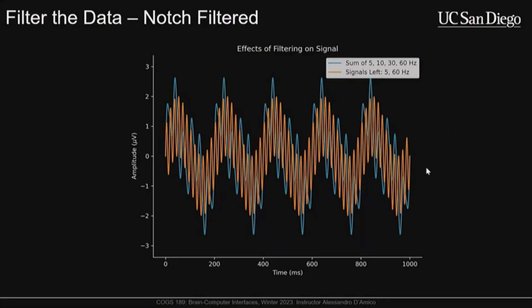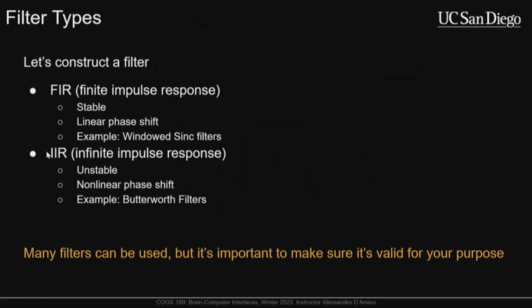But of course, because we have slower oscillations, we're also limited to a lower order set of filters. And anyway, in terms of raw computation, it can be a lot more efficient than processing audio, but in reality, they're both very complex and very different fields. But if you've ever tried to create your own audio processing or your own EEG processing toolbox and you try to do the other one, you'll find that you're creating a lot of the same functionality.